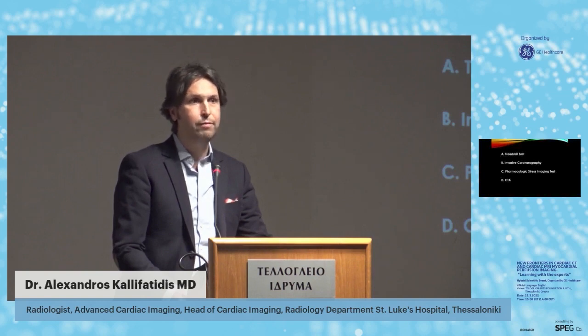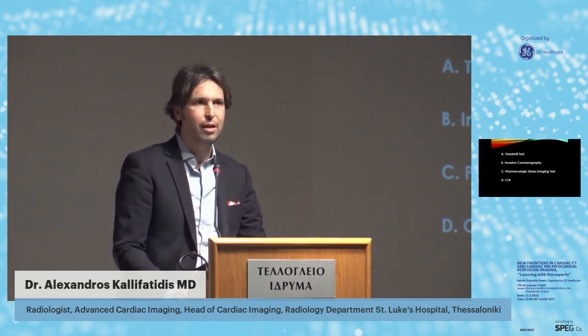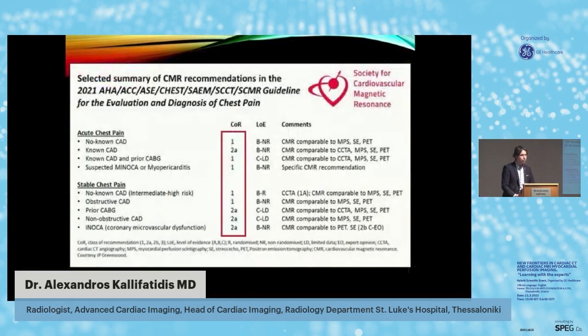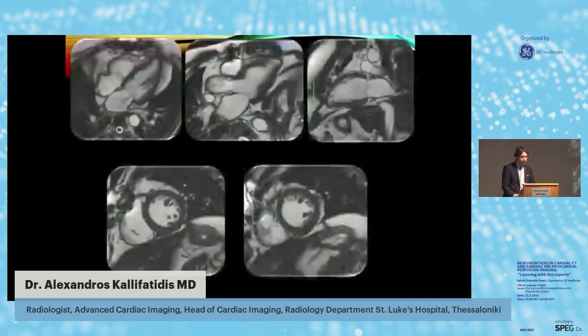Actually, when you deal with colleagues, it is always difficult to convince them to do further examination. For sure, he was reluctant to proceed with invasive coronarography. As I showed in the previous presentation, and according to the latest guidelines and recommendations, we can use CMR in the evaluation of chest pain, also in patients with prior CABG. And of course, we proceeded with stress perfusion CMR.